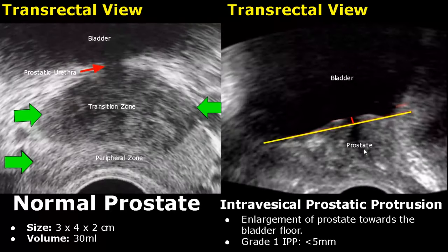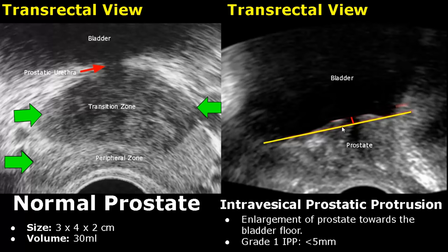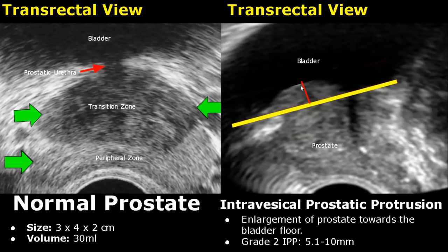Benign prostatic hyperplasia can lead to intravesical prostatic protrusion — the enlargement of the prostate towards the bladder floor. This imaginary line is the boundary between the bladder and the prostate, and here is the protruding prostate. Grade 1 protrusion will measure 5 mm or less. Here we have grade 2 intravesical prostatic protrusion, measuring between 5.1 to 10 mm.